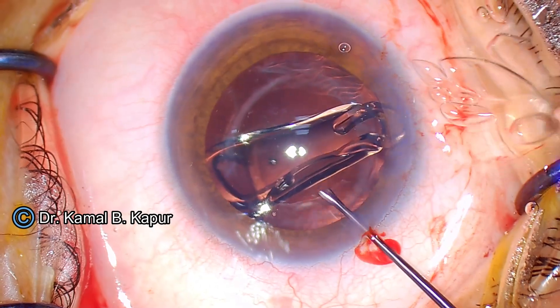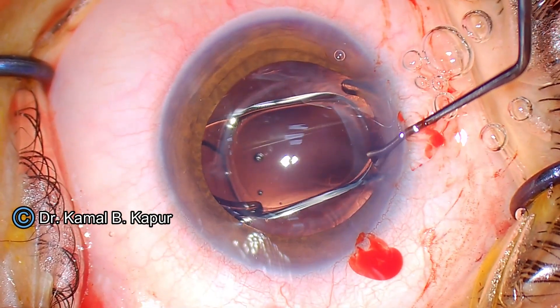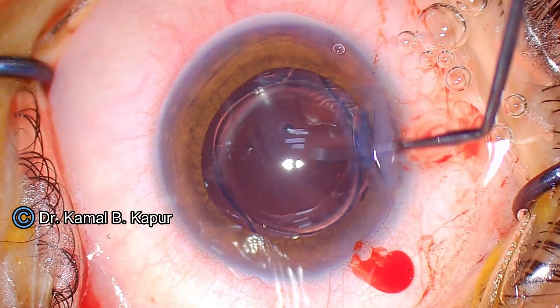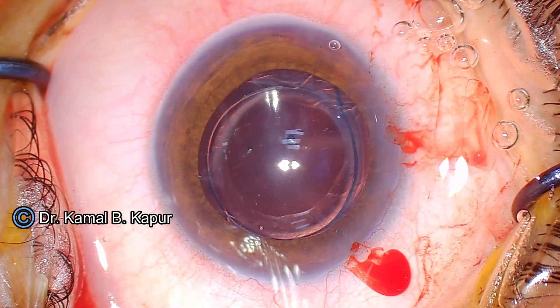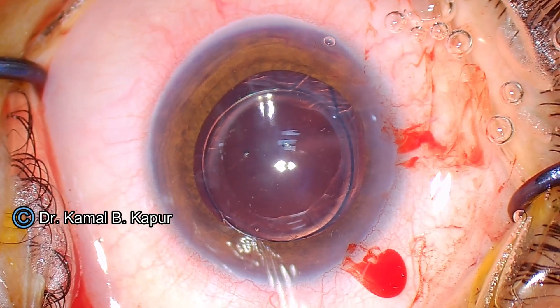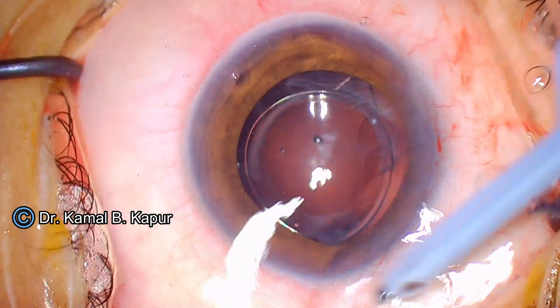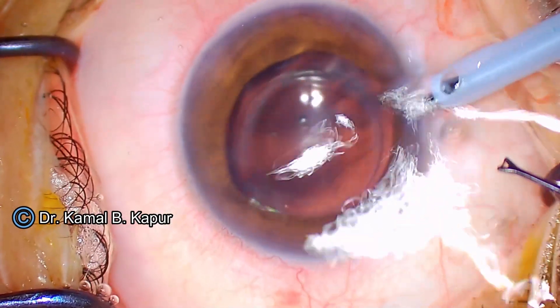From a 2.8 millimeter wound extended to 5.25 millimeters, putting a suture in the center creates two compartments of the wound, and this single suture is often good enough to do the job. If you are expert at putting interrupted sutures, you can use this limbal technique of IOL explantation and yet have minimal or even negative induced astigmatism.